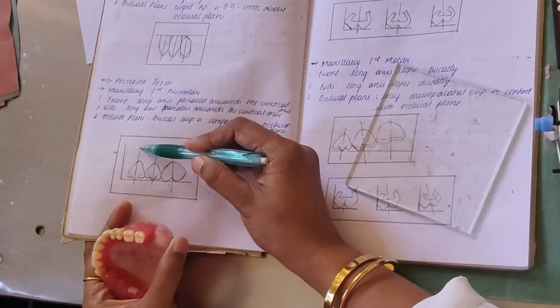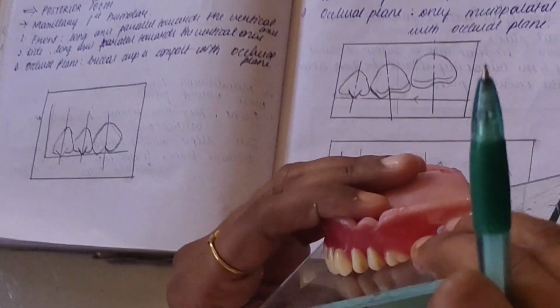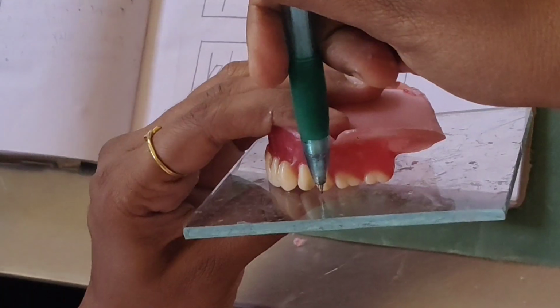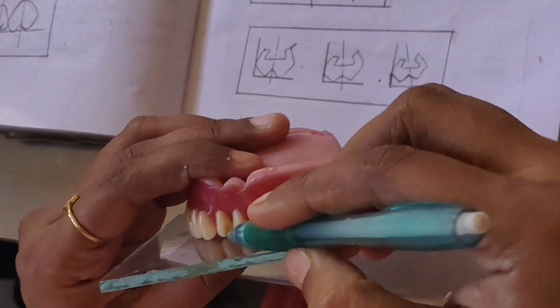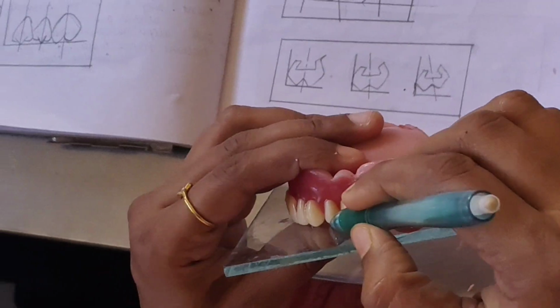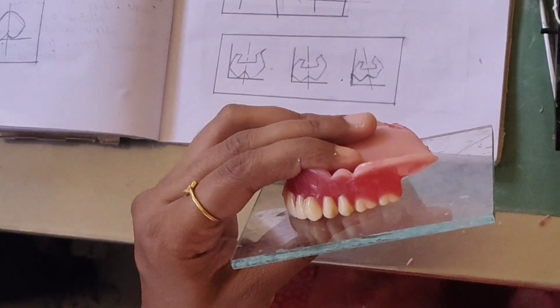Buccally, both the premolars will be straight. So when I am seeing buccally, both the premolars are straight. Glass plate relation: for the first premolar, the buccal cusp will touch, the palatal will not touch. For the second premolar, both cusps will touch.